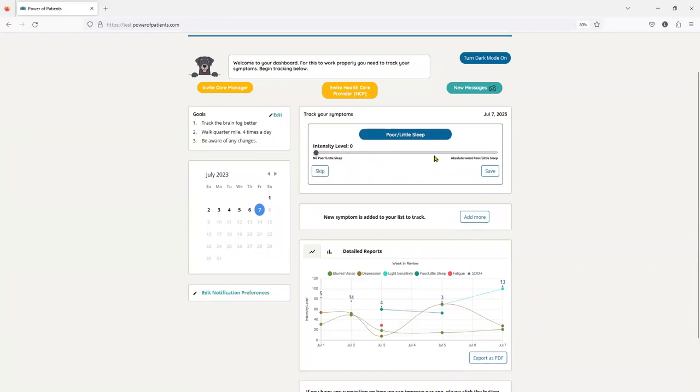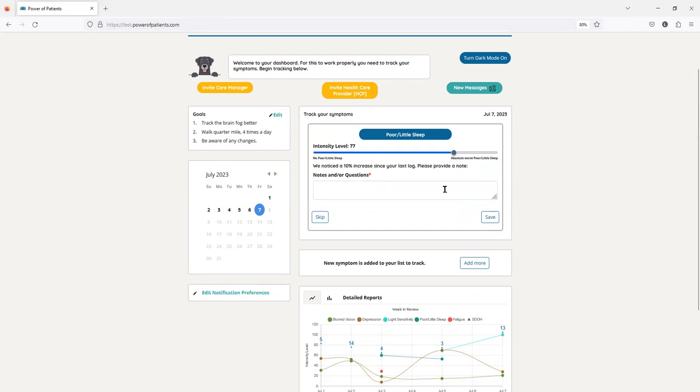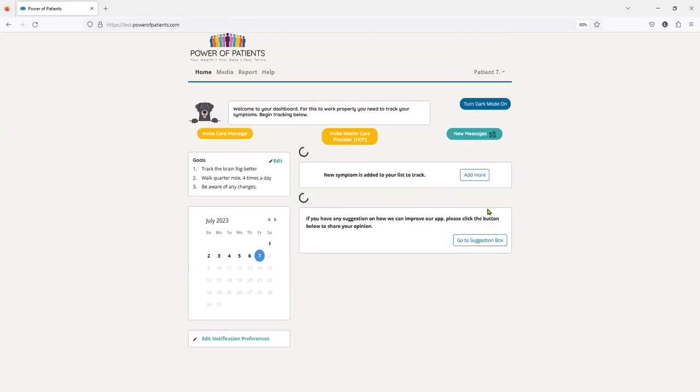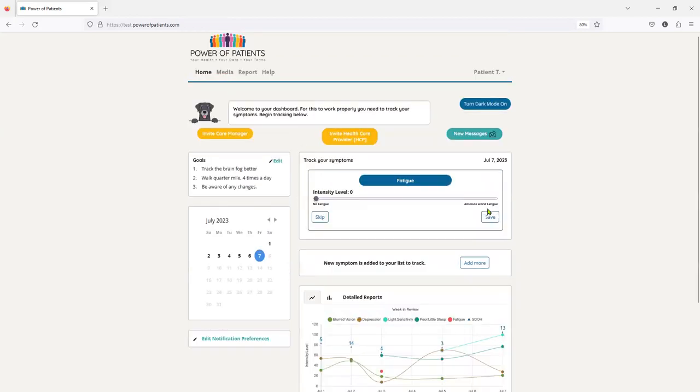Now I have to add in my poor or little sleep, and I'm going to say it's pretty bad. So because I was tracking poor or little sleep before, that's why this note has popped up. So I'm just going to add some gibberish. I'm going to click save, and I'm done tracking for the day.